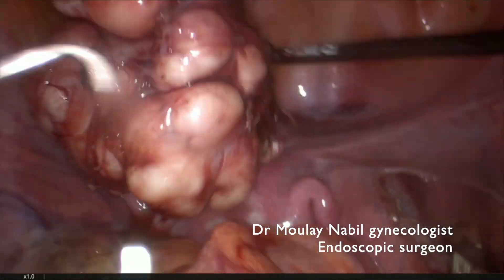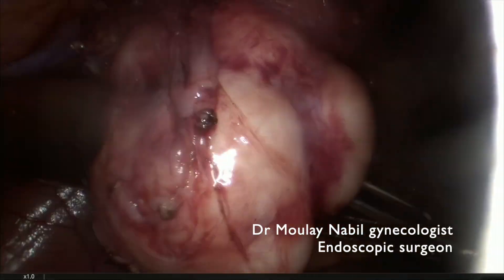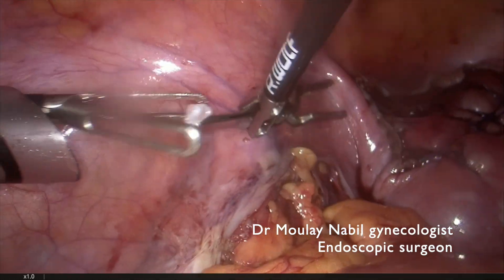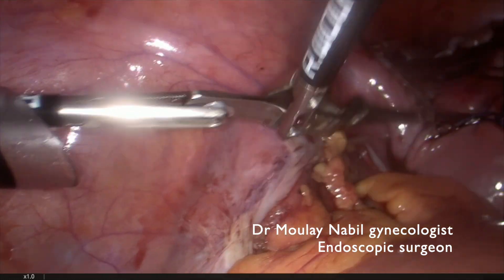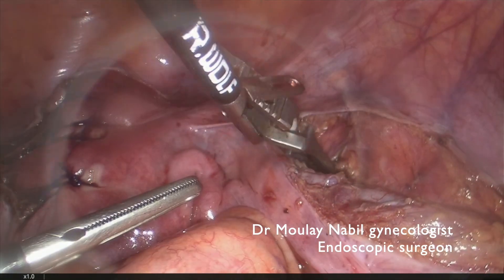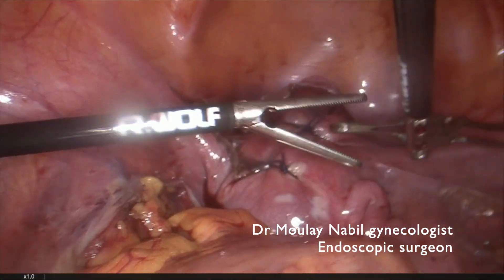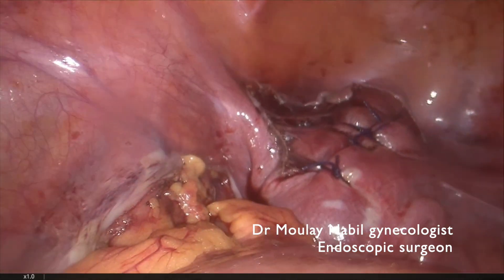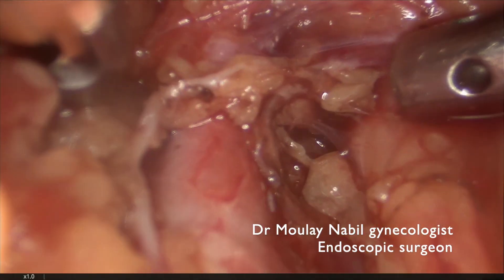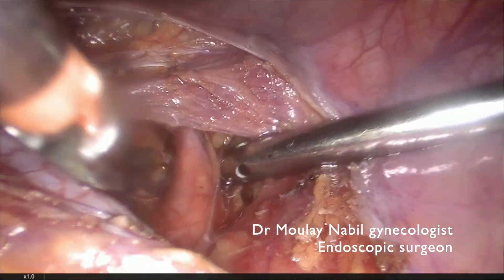It's time to do the morcellation. We use a 15 mm morcellator in the left iliac fossa trocar, and we have to remove the bulldog clamps after the procedure. The procedure is very easy and bloodless, even for a cervicoisthmic myoma. We verify there is no occult bleeder on the internal iliac artery, clean the pelvis, and the job is done.